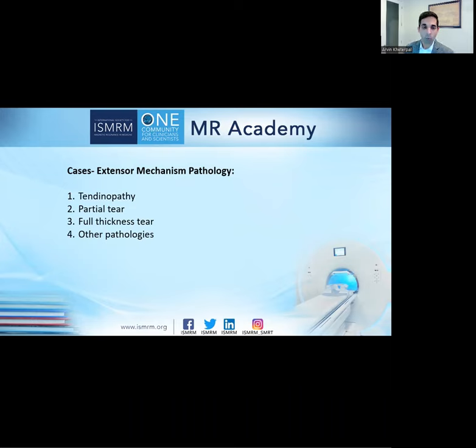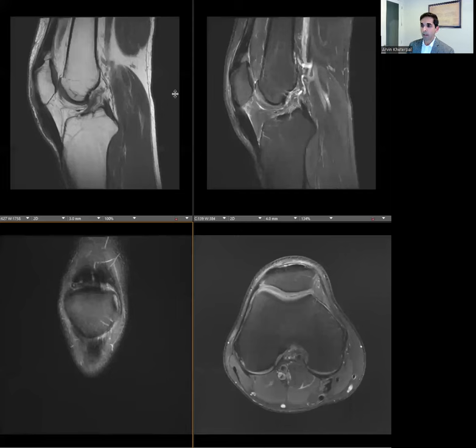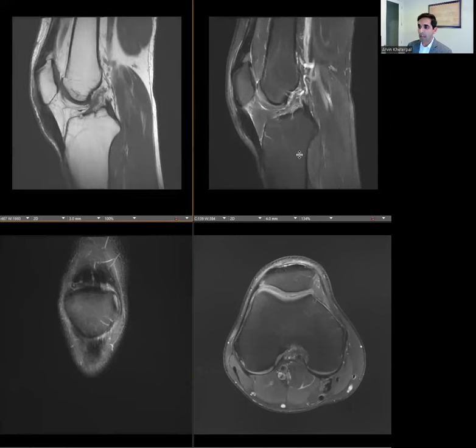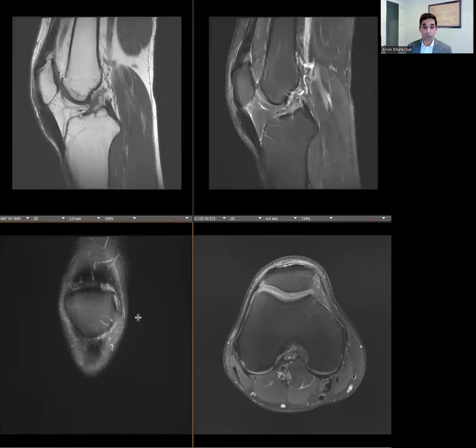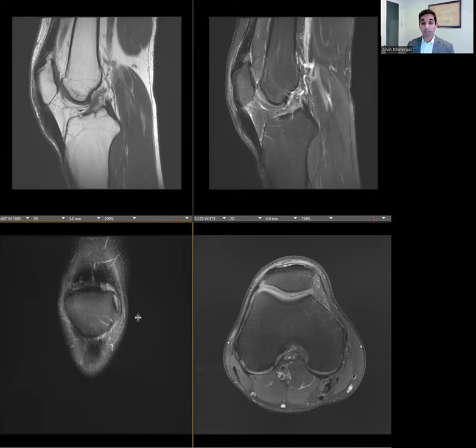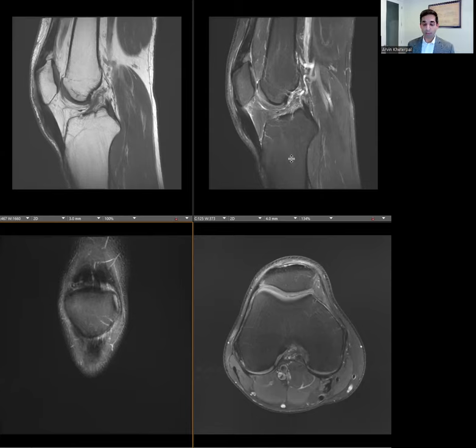Now that we've looked at the normal anatomy, we're going to look at some cases and discuss an approach for evaluating the extensor mechanism. Whenever I'm evaluating tendons, I like to ask: does the tendon look thickened? Is there abnormal signal within it? If yes, is it fluid signal — meaning a tear — or just higher signal, meaning degeneration or tendinopathy? Then I ask what's happening in the soft tissues and bone around the tendon. I try to structure my reports in that way.